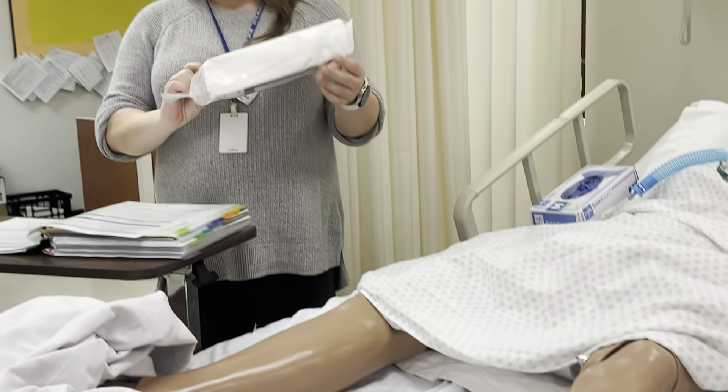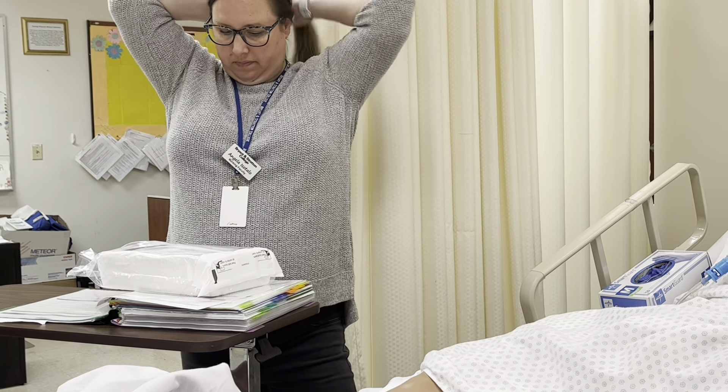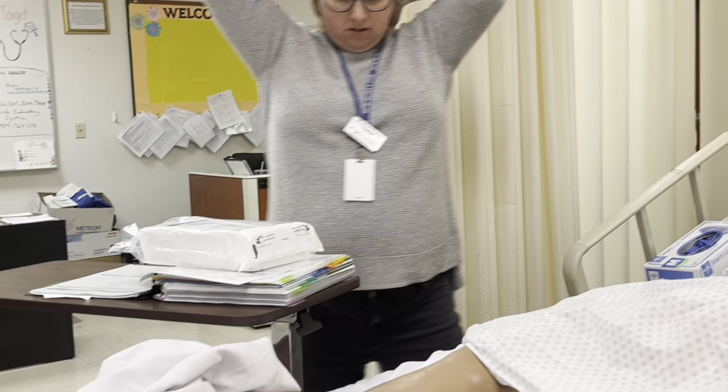The kit is completely sealed. It also tells you it does not contain any iodine, so just in case you have an allergy, you're not going to be exposed. It also comes with latex-free gloves, just so you're aware.